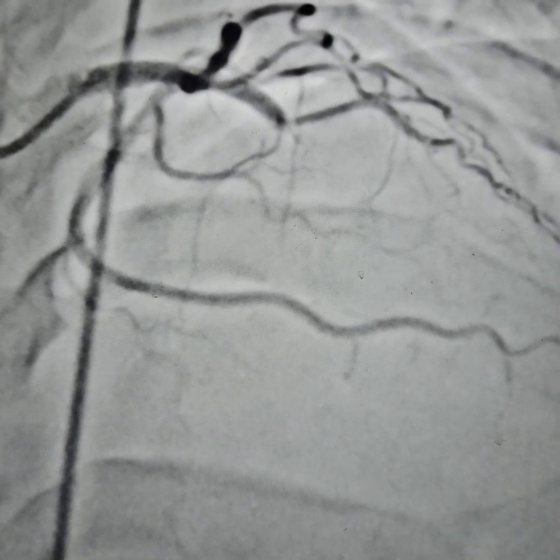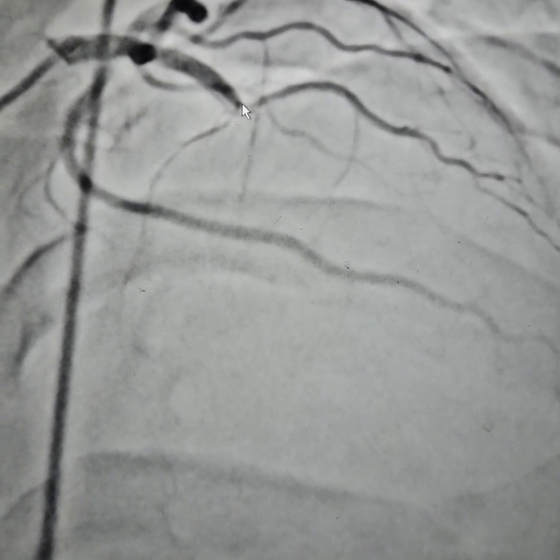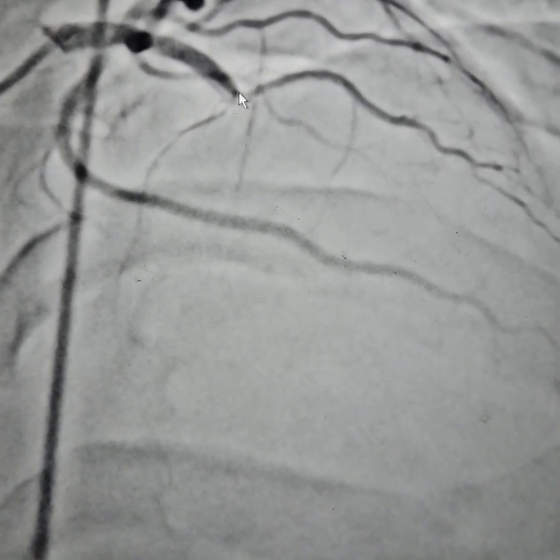We tried the right radial route first; however, because of excessive tortuosity, as you can see, we proceeded with the femoral route. The LAD — you can see 100% blockage right here — is clearly showing a complete occlusion.